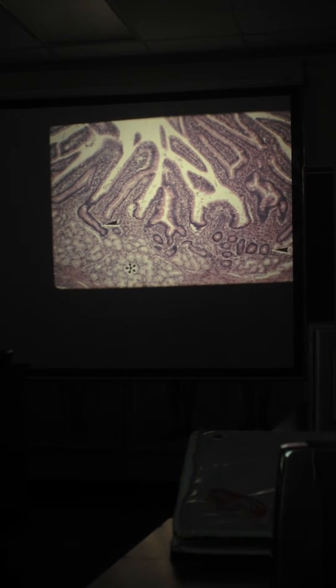And then here, more magnified with the fingers, small intestine, mucus cell clusters underneath, Brunner's glands, so just another specimen of duodenum. But here was the first time where we said, yeah, this, the same as this. 3D.